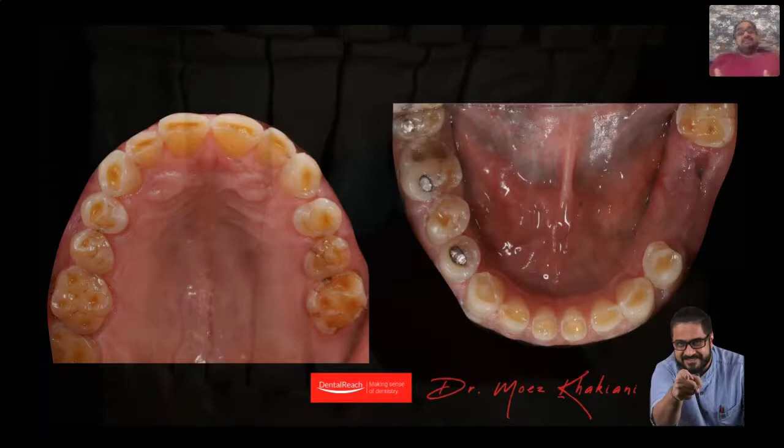There is so much dentin that has been exposed. Look at the mandibular teeth that are missing. This patient happened to vertically fracture the molar and the premolar there. Why? Because there was excessive amount of stress and strain on the system. Those two teeth, which are endodontically treated, fractured.